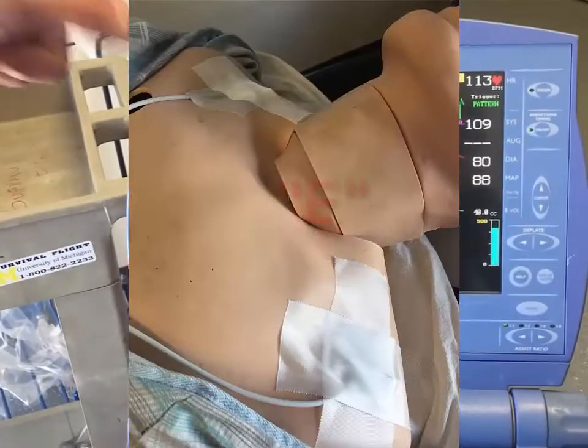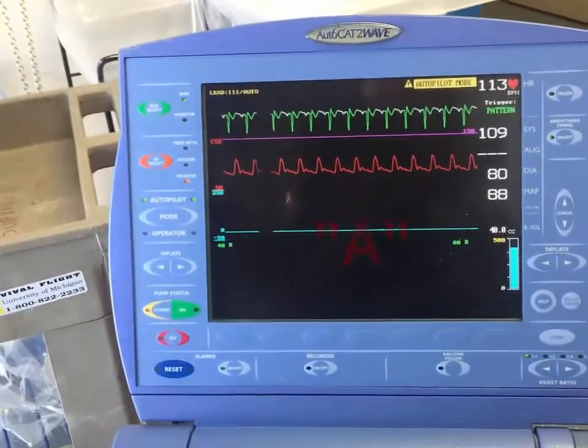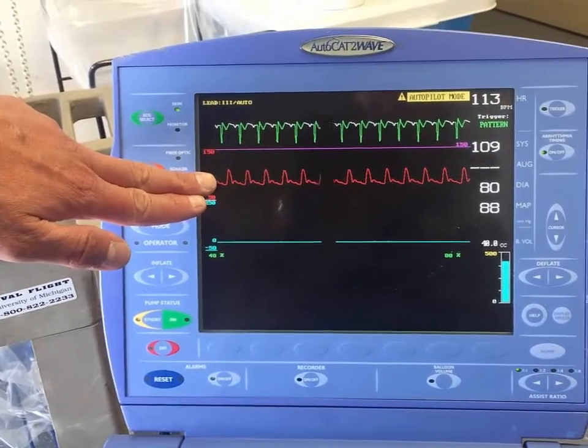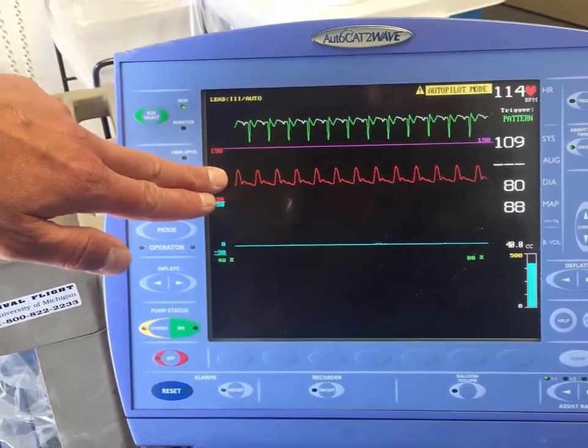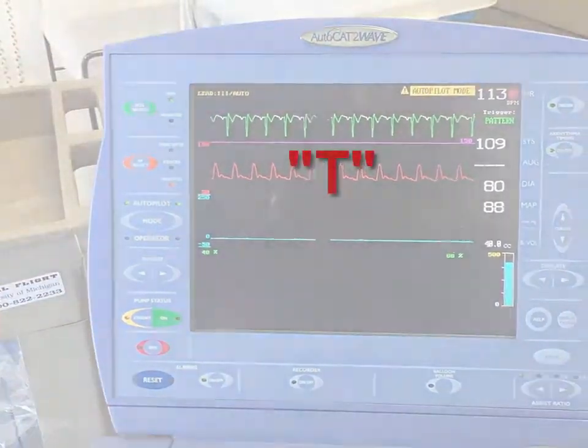Helium is attached. ECG electrodes are on the patient and taped down. We have zeroed our arterial line and attached it to the insertion site or catheter. We have our trigger established.